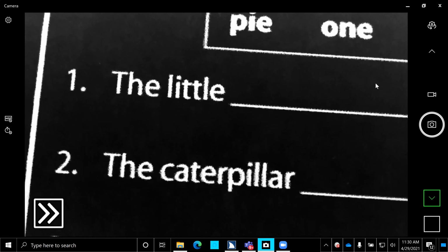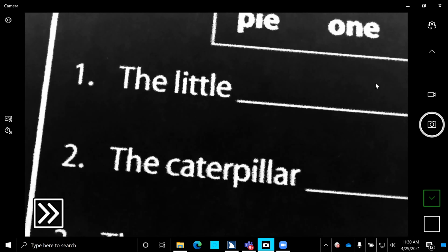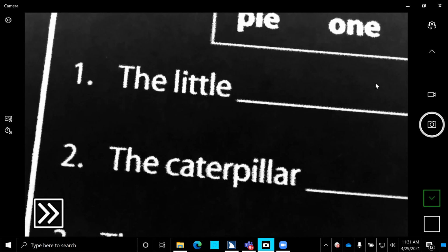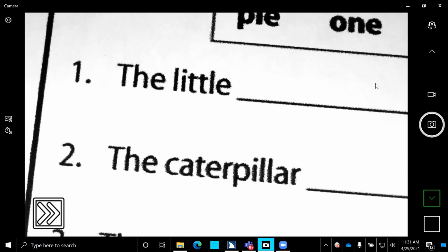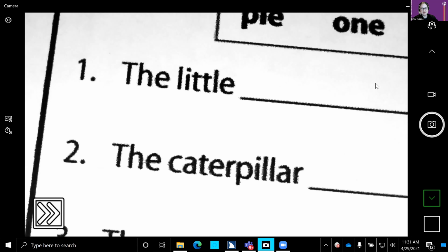Every time you press these buttons, it'll tell you what it's going to do. So I'm going to try to get my microphone close to it. Change color mode to grayscale. If I hit the up arrow, change color mode to black on white. If I tap it now, it actually does it. So now you guys should be seeing it as black on white. It should toggle in and refocus. And let me know if you're not seeing that because I can't see that at all. Oh, we did. All right, great. I'm going to toggle it again.